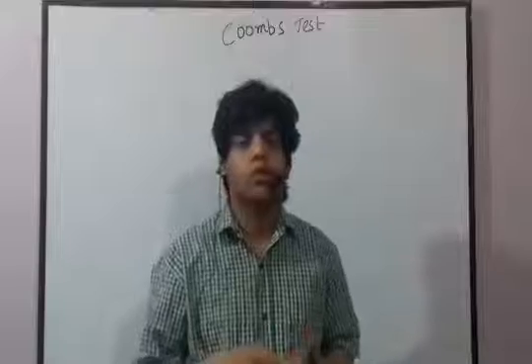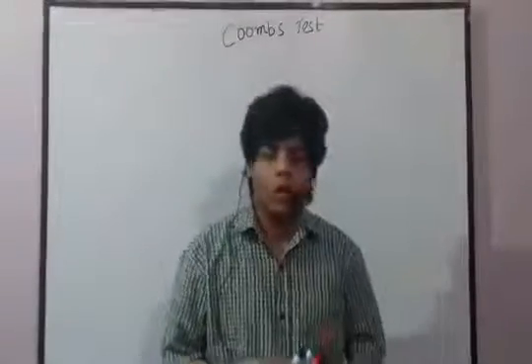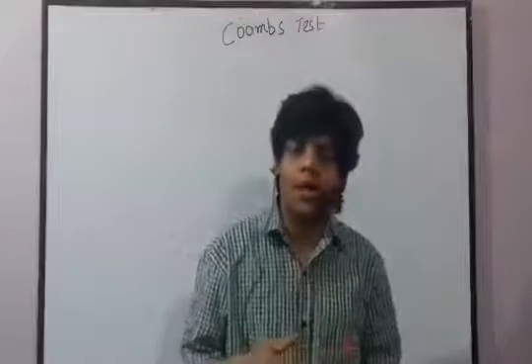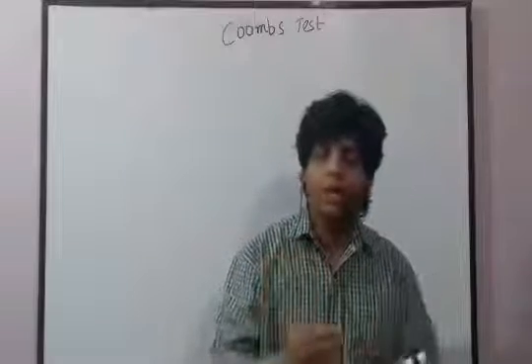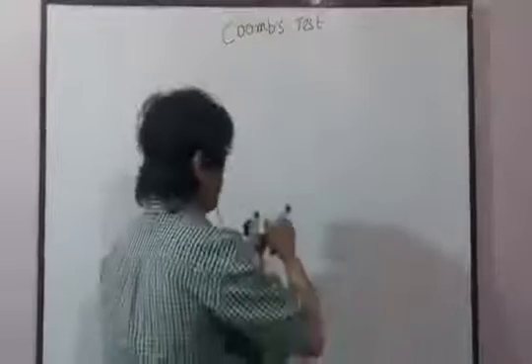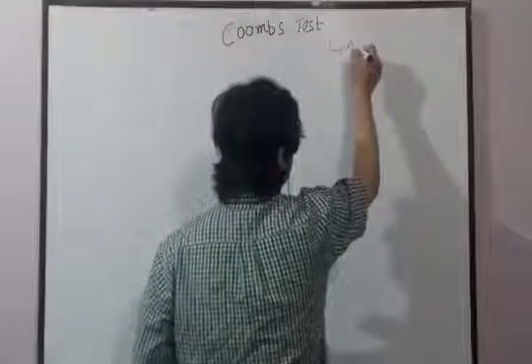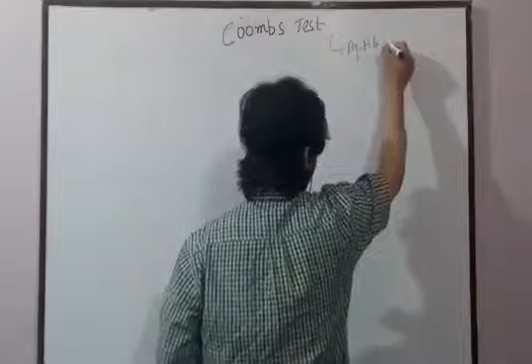In this video lecture we are going to talk about Coombs test. Now what is Coombs test? Coombs test is a kind of test in which we can identify the antigen antibody interaction inside the body of a patient.